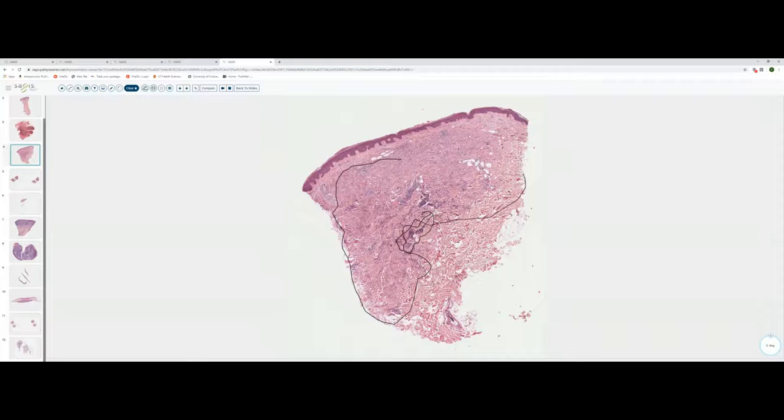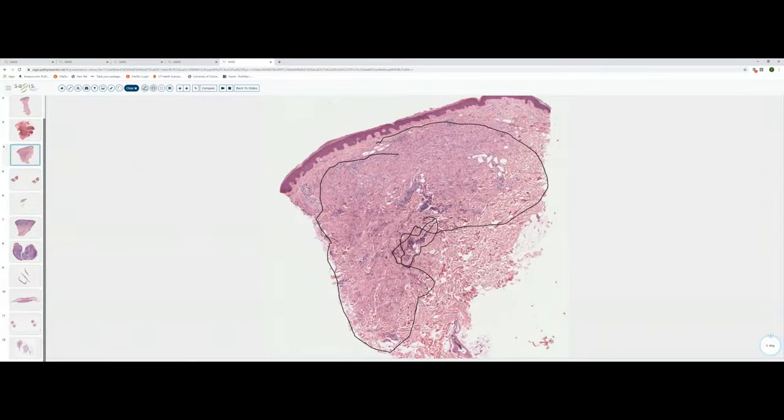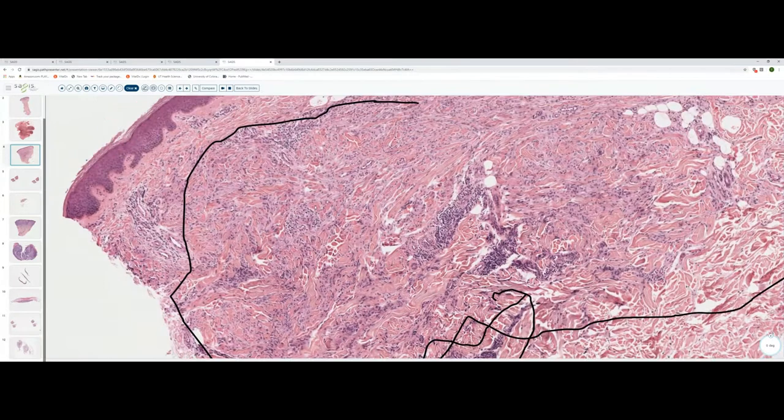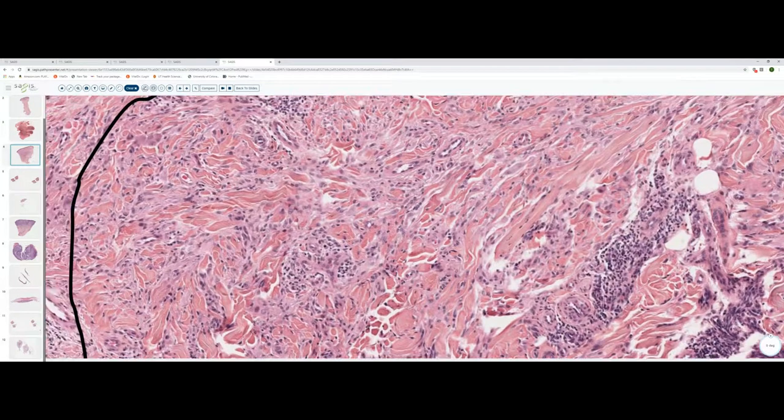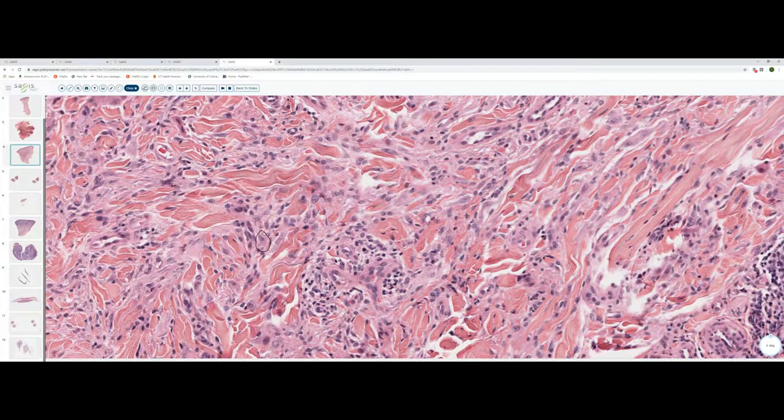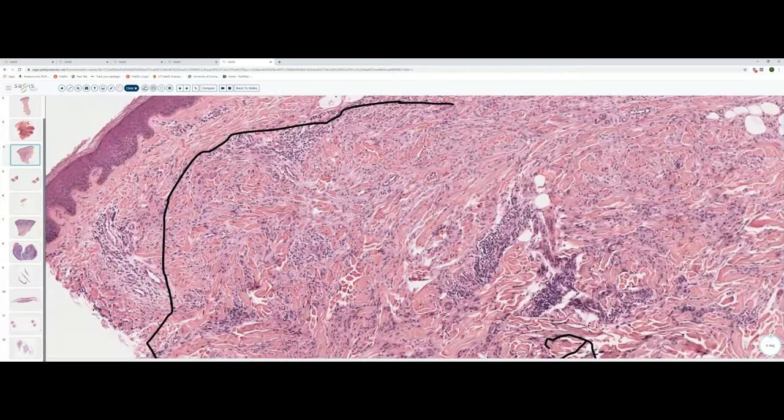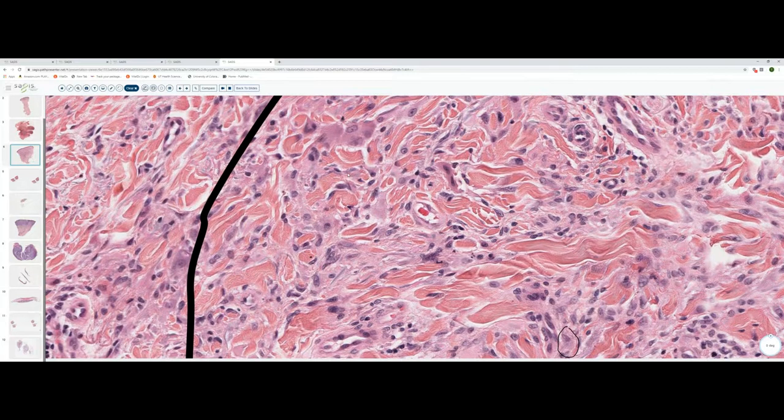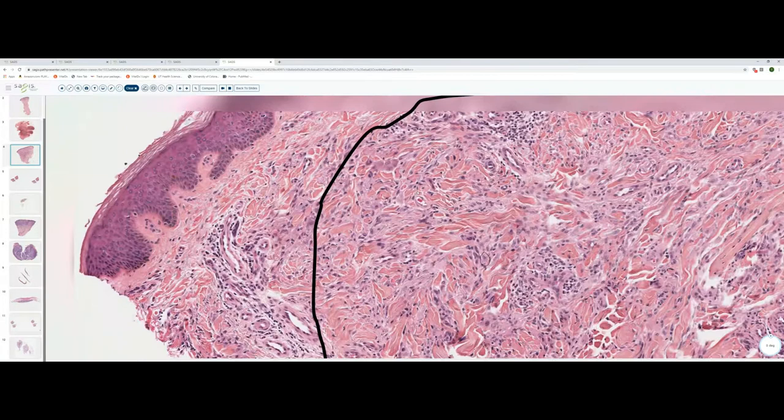In other words, they have more cytoplasm. The epidermis appears uninvolved. And as we move to higher power, we can see that these cells have round to oval nuclei and fairly abundant pink to slightly clear stained cytoplasm. The cells are arranged interstitially between collagen bundles. And in some areas, there's a slight increase in the amount of mucin present between the collagen bundles. And this is an example of GA, granuloma annulare.